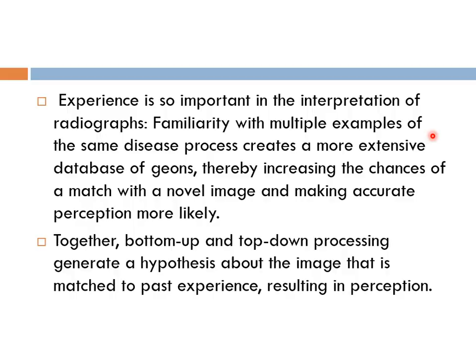This is why experience is so important in the interpretation of X-rays. Familiarity with multiple examples of the same disease creates a more extensive database of images, thereby increasing the chance of a match with a novel image and making accurate perception more likely. In fact, this may be the most important word in science: experience. You cannot buy experience. You can buy a nice machine, good contrast medium, a very nice printer, you can buy everything, but you cannot buy experience.